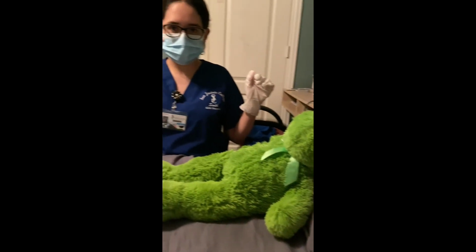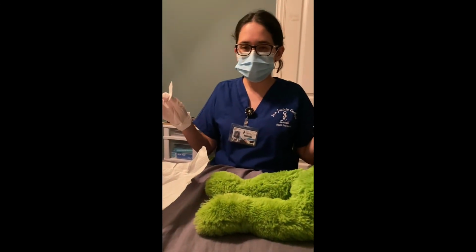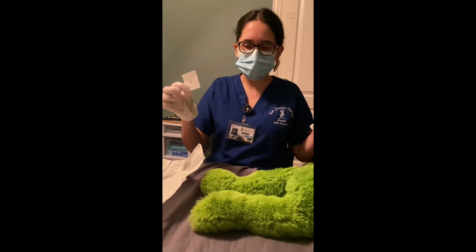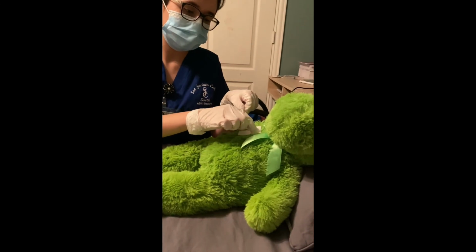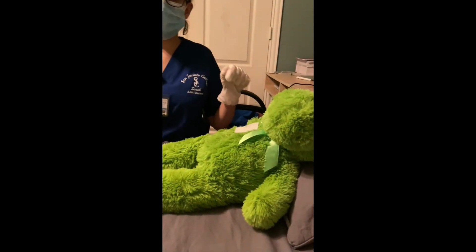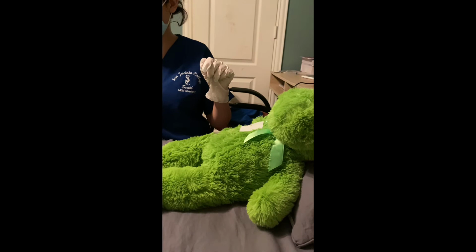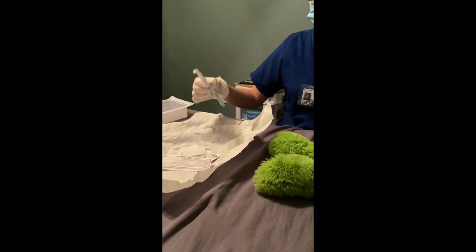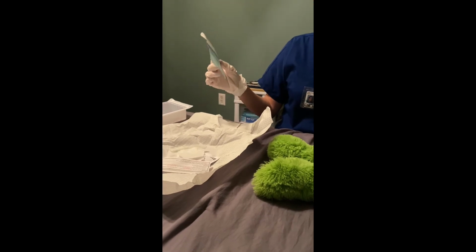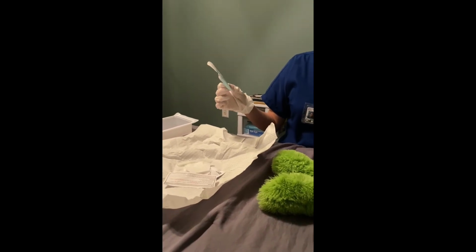I'm not going to blow it or anything. I'm just going to wait for it to air dry. Both hands are still sterile, so I'm going to apply this to the patient's site. Okay, and then I'm also going to grab the clear transparent dressing, and I'm going to apply it to the patient.